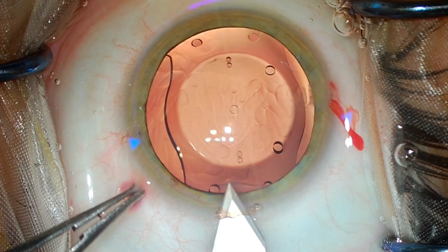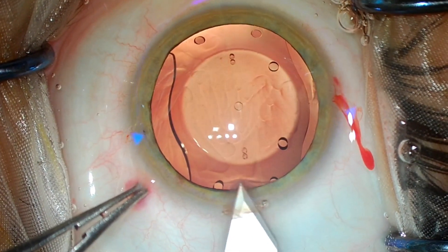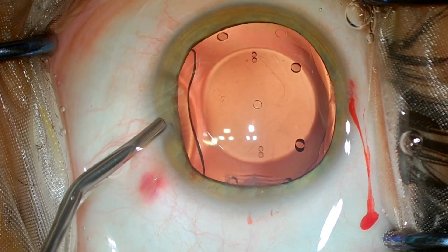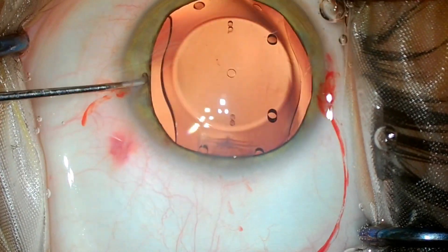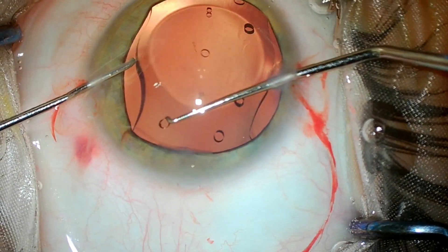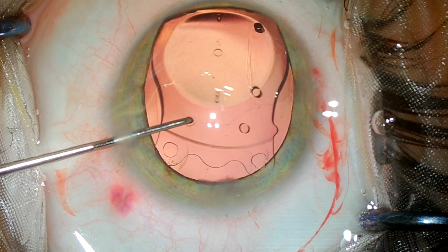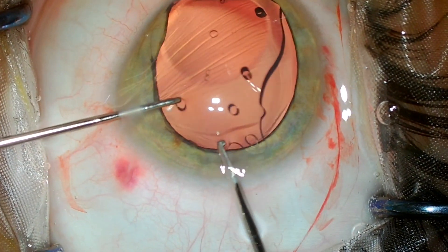This is three weeks after the first surgery. I am re-opening the same incision — it's very easy to do. These are custom-made IPCLs, so you have to send the measurements and they make the IPCL for that particular patient. Here I am injecting 2% methylcellulose underneath the IPCL to make some room, and then using the Sinskey hook I am going to push it out of the sulcus. Then I hold it and use the blunt capsulorhexis forceps — a micro forceps.